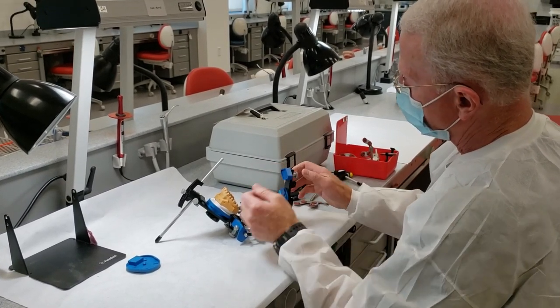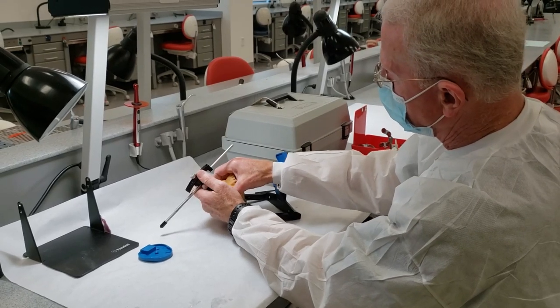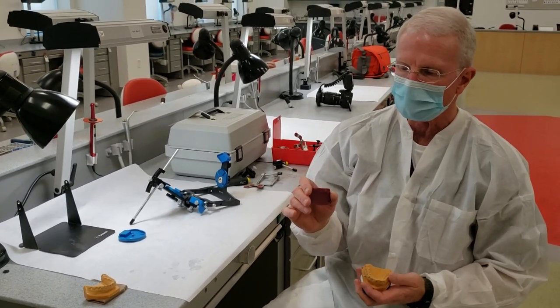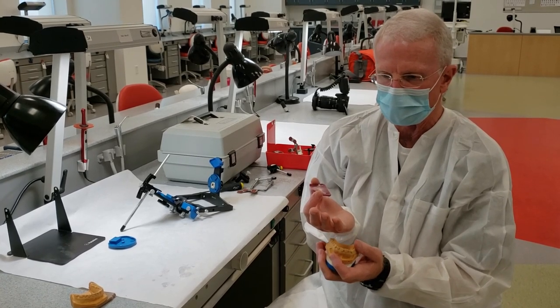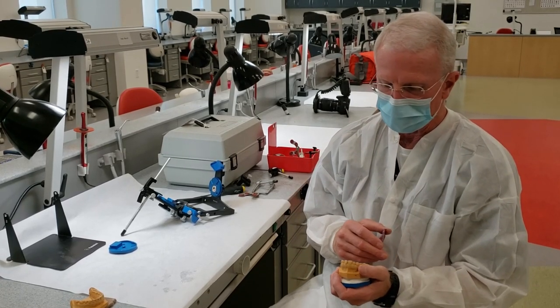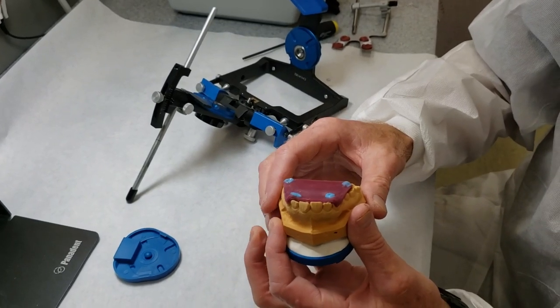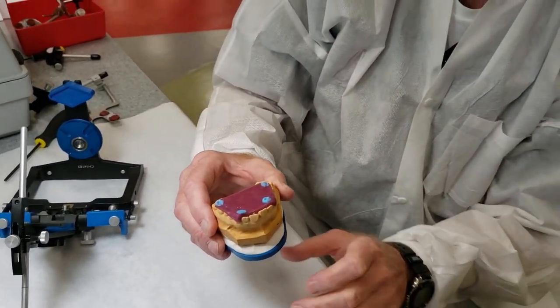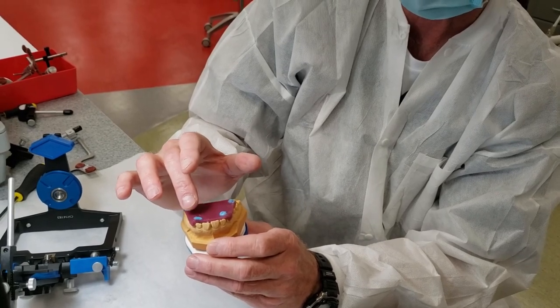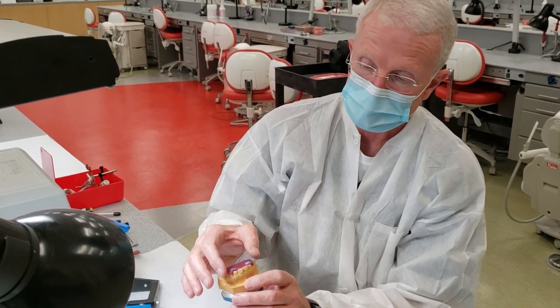We'll take the transfer assembly off and go back to our incisal guide table, put that on — we've already set it at zero. Something good to do at this point: the mounting we're doing is a centric relation bite record, taken in a slightly open position. It's a condylar axis record and really has nothing to do with the way the teeth fit together. Whatever method you use for recording centric relation, try it on both arches separately. The upper arch should sit very stable; if I push it on one side and it tips up, it's obviously warped and inaccurate.